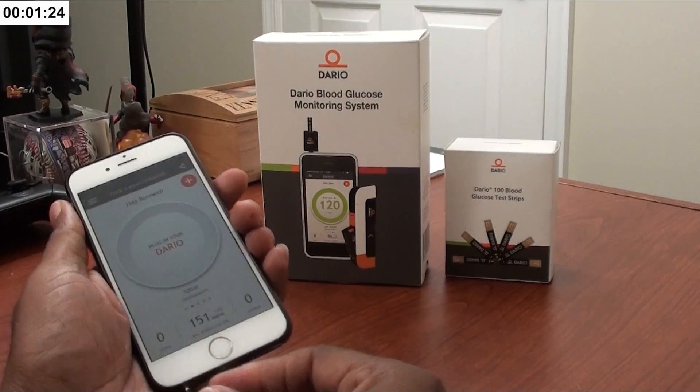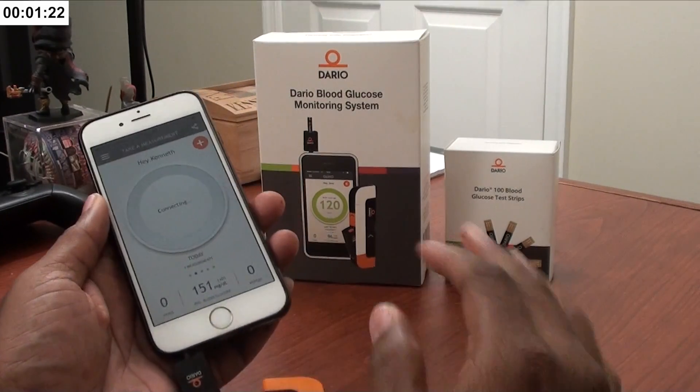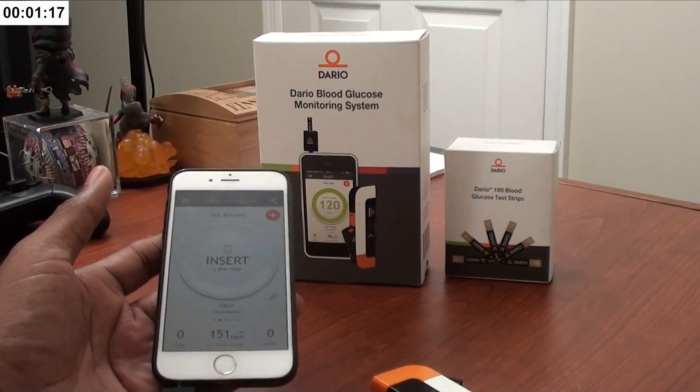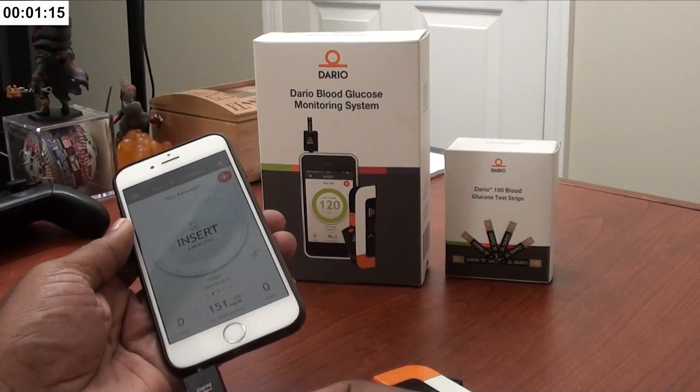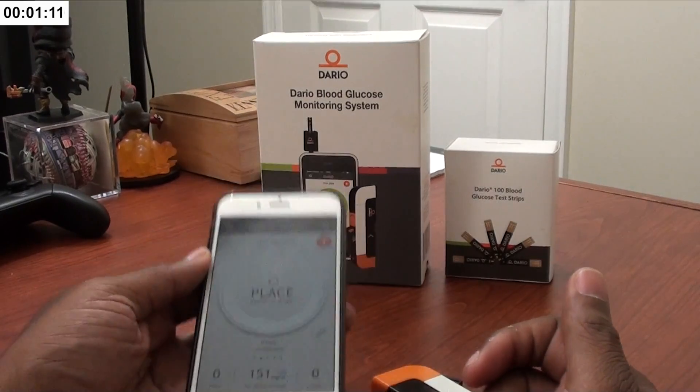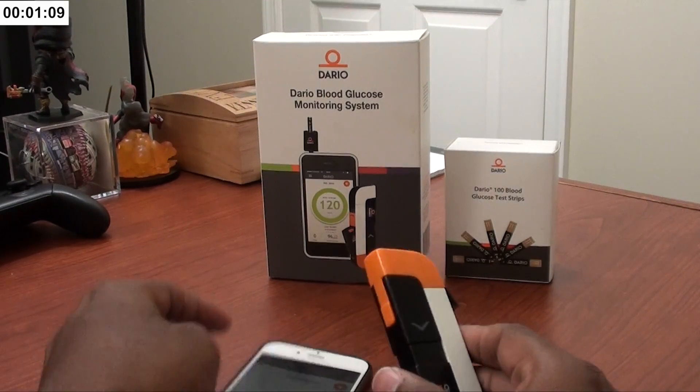You stick this piece into your sound jack. For those of you with iPhone 7s, don't worry — it works with the little sound jack adapter that it came with. Take a test strip, stick it in here, and once you do, you'll see it's asking you to place a little bit of blood.